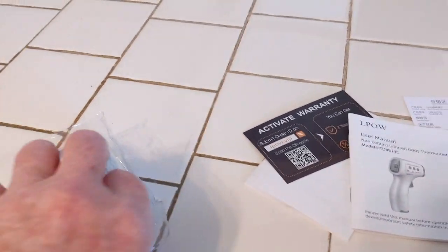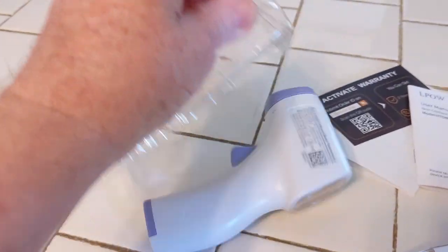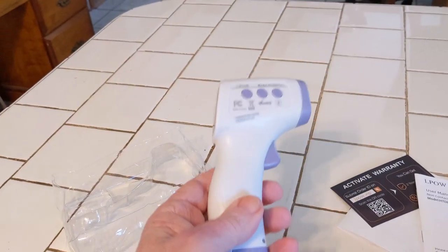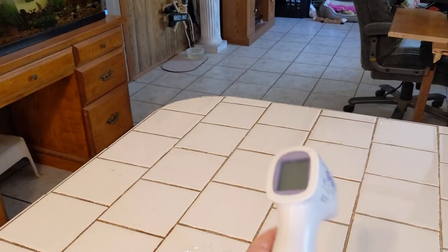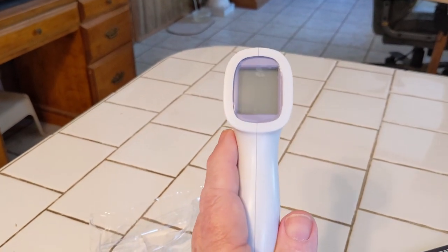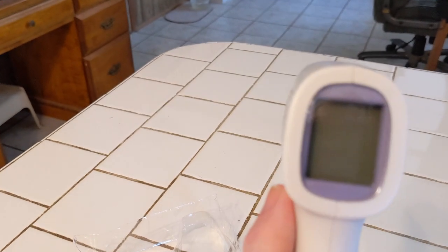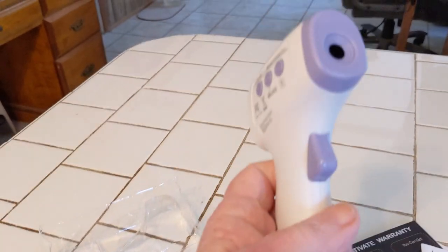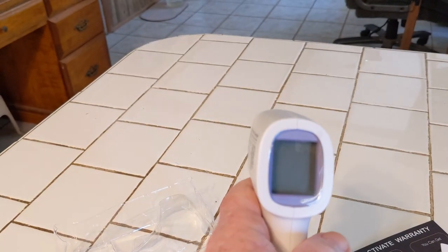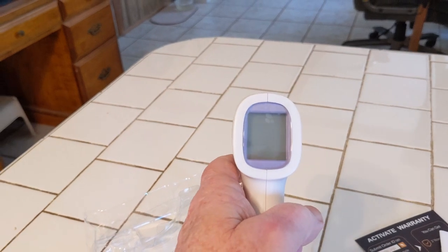Here's the unit itself. It's kind of in one of these plastic things here. So there it is. This is the thermometer itself. The readings are on the back. It's got some film over the top of it that we'll need to remove. Pretty simple — just squeeze and click. We're going to demonstrate that here in a second.